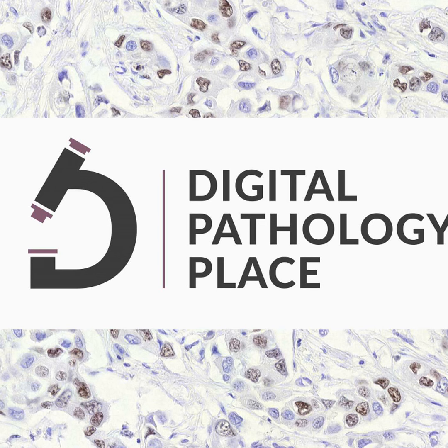This allows pathologists to access the necessary patient data directly within the digital pathology interface, fostering better informed and quicker diagnosis. Additionally, pathologists can directly upload their reports to the LIS, reducing transcription errors and improving turnaround times. The integration of digital pathology with EHRs offers even more extensive benefits.